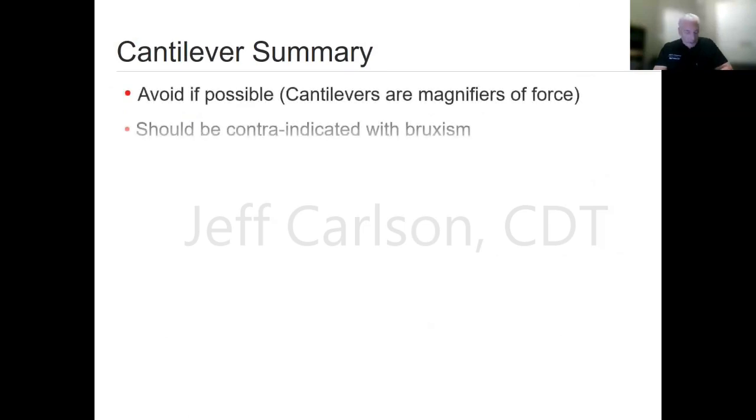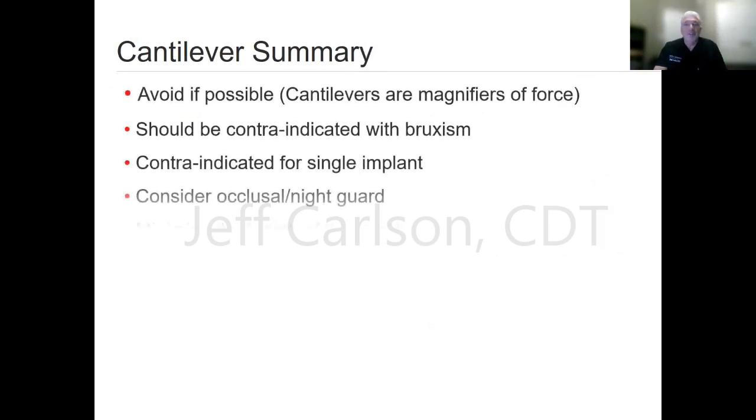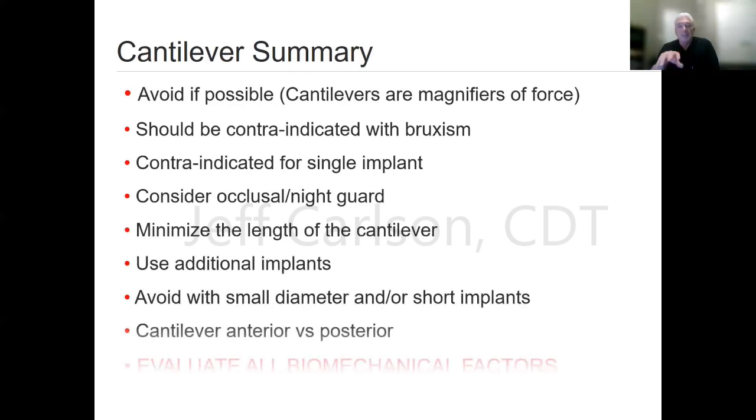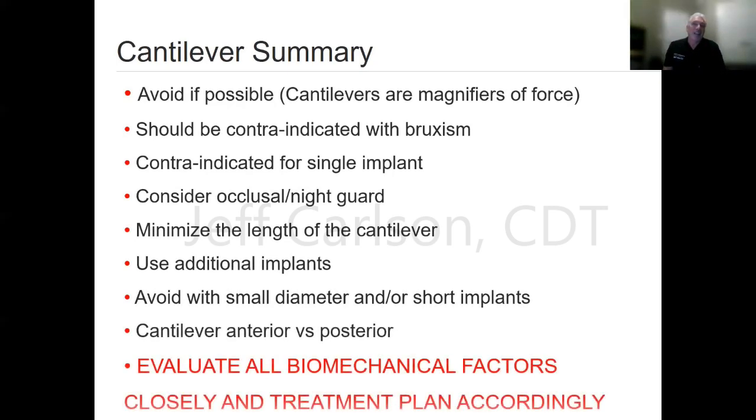We're getting really close to wrapping up, so we'll have a few minutes for questions. This is one of those slides that you're welcome to take a snapshot of. It's a lot of information there, but really with cantilevers, I just say avoid when possible. And if you're going to do it, really evaluate the pros and cons of it. What can you do to minimize the impact that potentially could happen from that cantilever?